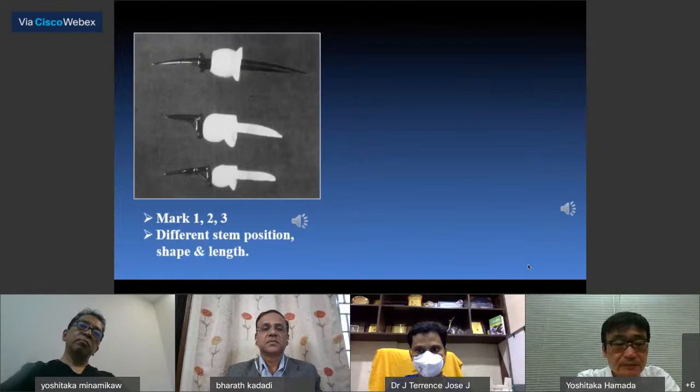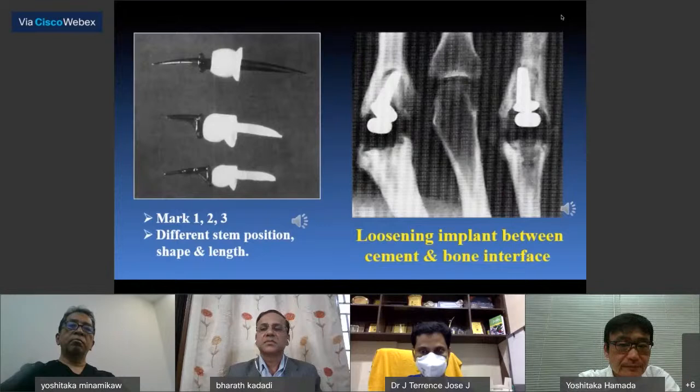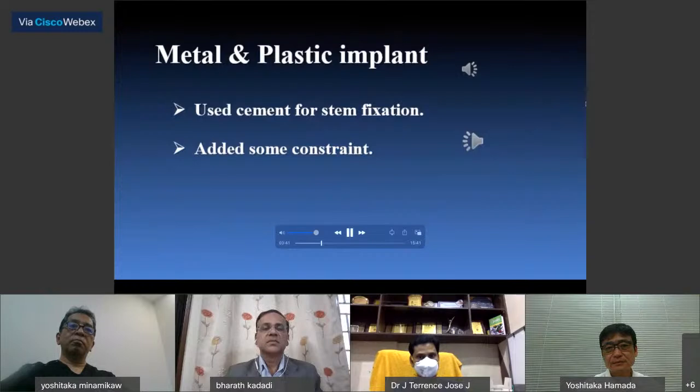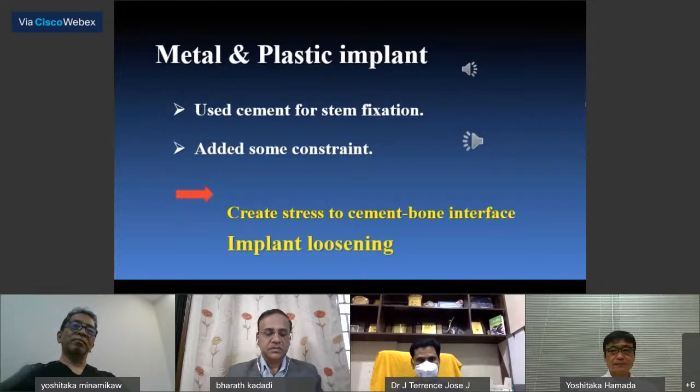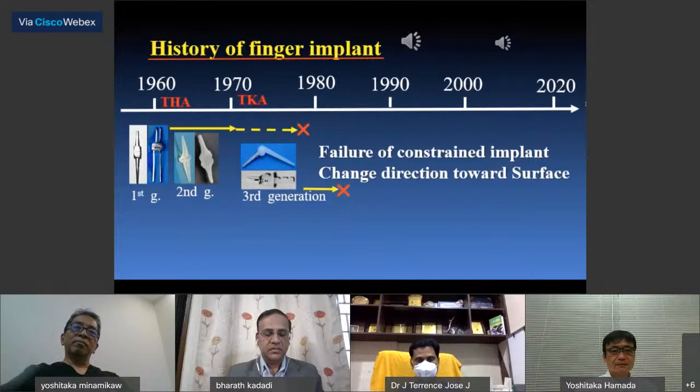However, loosening at the cement and bone interface was found in many cases. The metal and plastic implants of the third generation used cement for stem fixation and added some constraint. What they learned was that any constraint in the joint itself created stress at the cement-bone interface, and the result was implant loosening. Doctors of Mayo and others had learned the failure of constrained implants and changed direction toward surface implants.